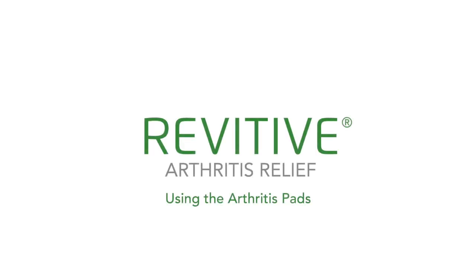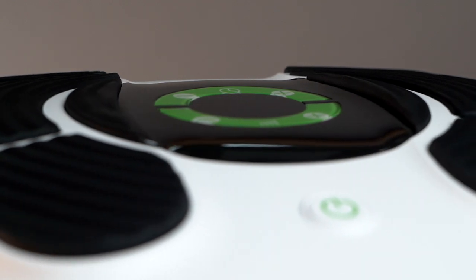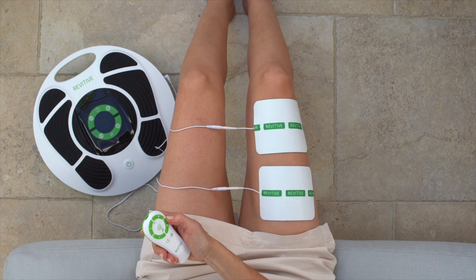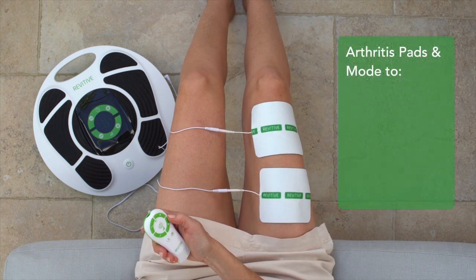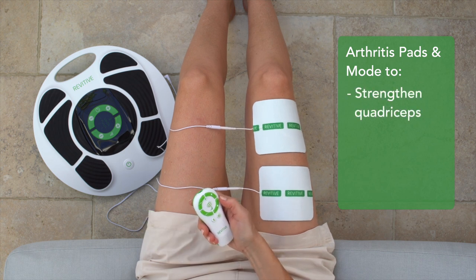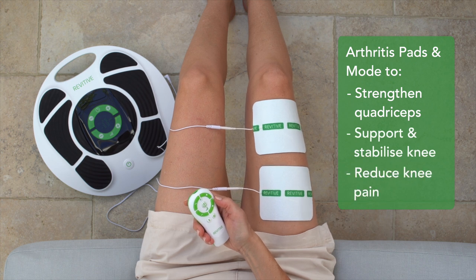Thank you for joining us. This video is part of a series to help you set up and use your Revitive Arthritis Knee device. In this video, we'll show you how to use the arthritis pads. Revitive Arthritis Knee comes with two pairs of large reusable arthritis electrode pads and a unique arthritis mode to strengthen your thigh muscles, which may help to support and stabilize the knee and relieve knee pain.